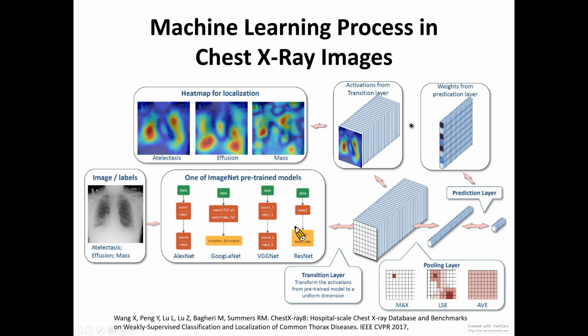And these models have been trained using ImageNet, which is a large collection of real-world objects containing hundreds of thousands of images, and they already used lots of computation time to train this model to identify objects, for example, from very simple ones like trees, flowers, cats, dogs, to complex ones like a flag or traffic signs or different words.